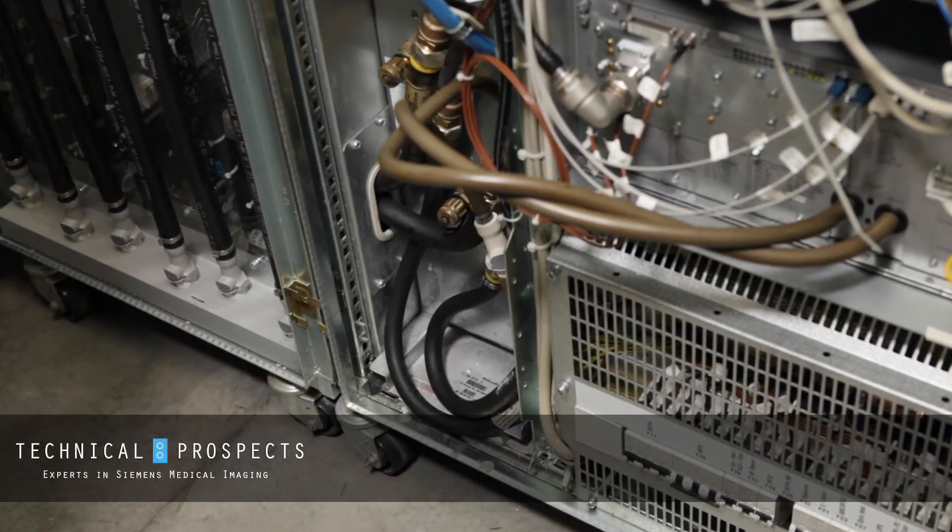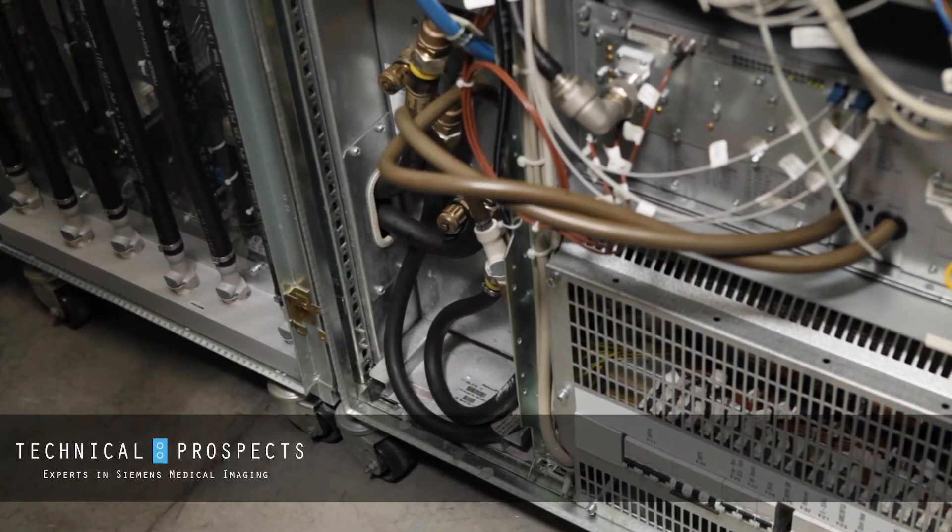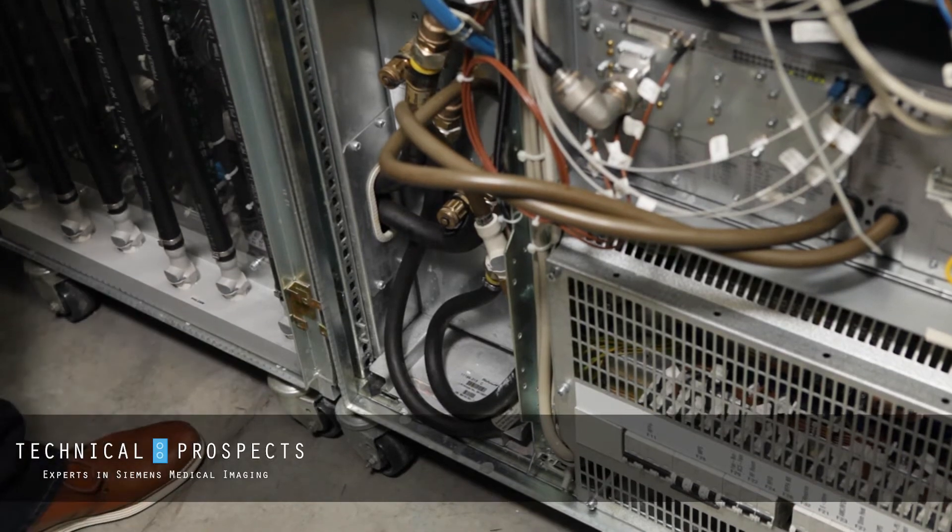When performing our PM, we must check our water cooled components in our MRI equipment room. We'll start here at our power amplifier.